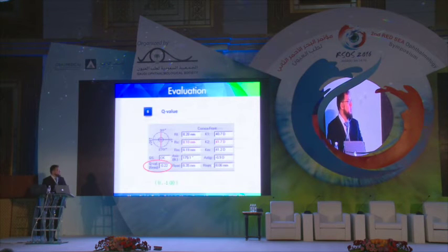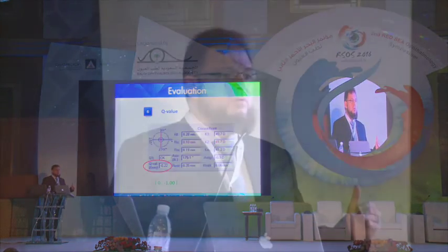The normal Q value is between 0 and -1. Above -1, like -1.234, it means that the cornea is very prolate, very steep, like after hyperopic treatment and like keratoconus. While we see plus, like plus 0.5 or plus 1, after myopic ablation, the cornea becomes very oblate, very flat.